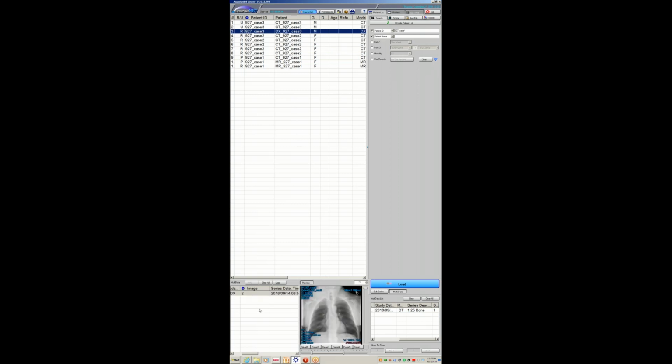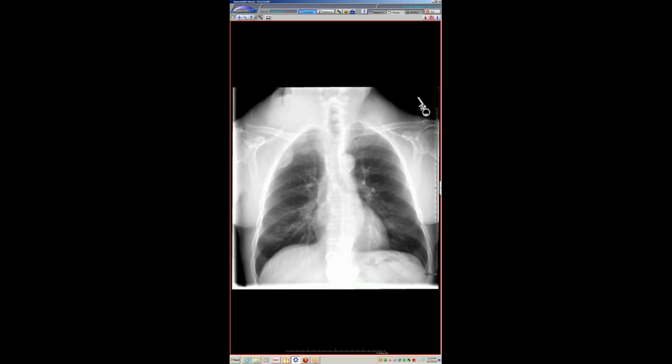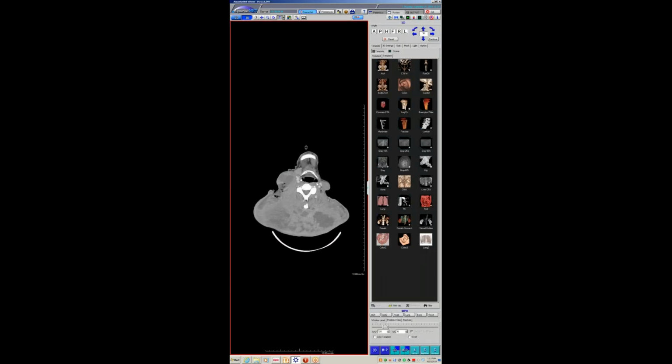And then the last case, I'll show you guys. I don't have an answer on this yet. What I thought it had to be, it turns out they're not finding yet. Here's a guy who came in off the street, a homeless, psychotic man for 20 years, who has not a normal chest x-ray beyond the pleural lesions or extraparenchymal lesions, I can't tell if it looks pleural, and all this very interesting soft tissue sitting there. So I had them reformat the neck CT.